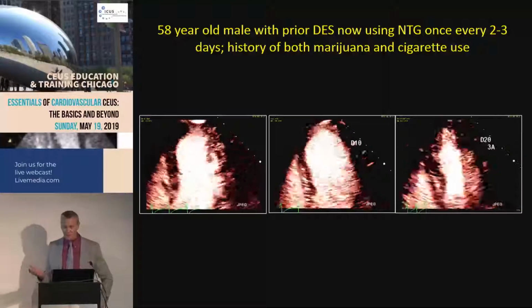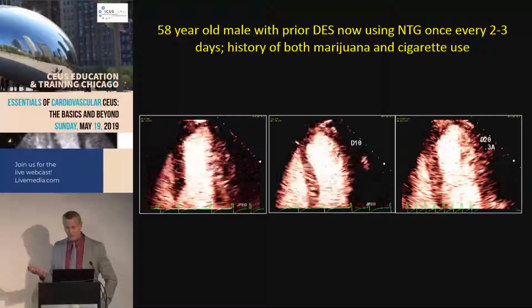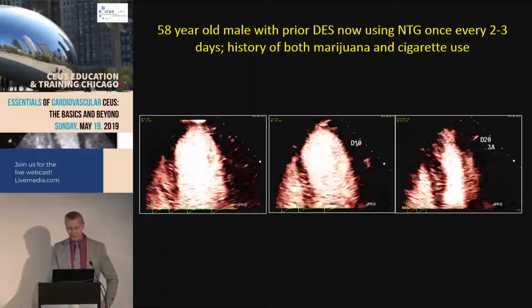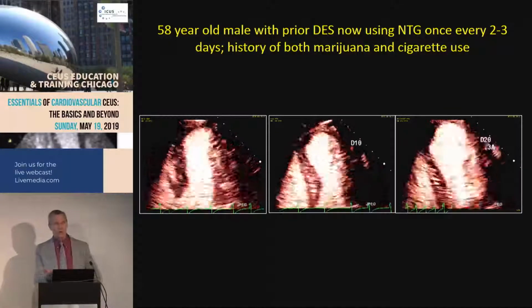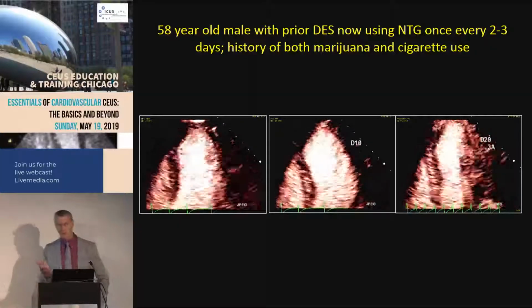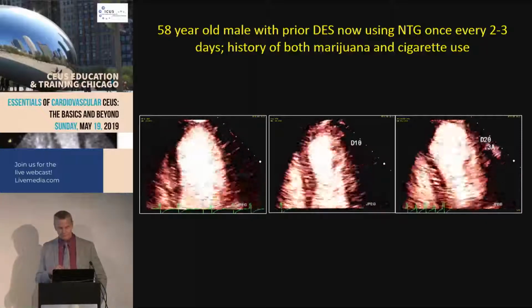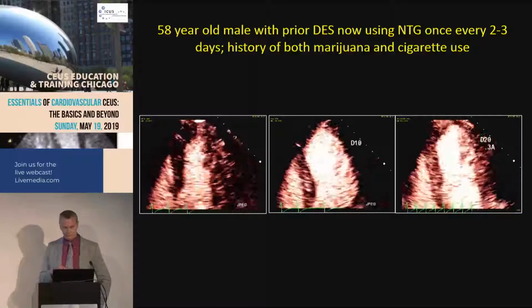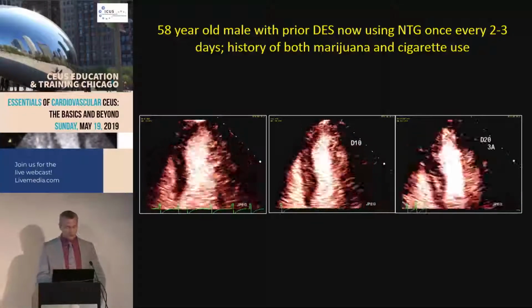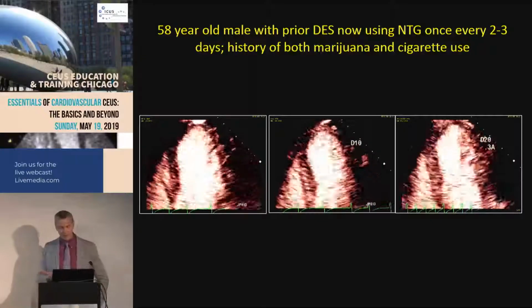But this guy had been using both, but he'd also been using more nitro, and then he had this history. So what do you guys think? So here's low dose. We always do an infusion about when they get a slight heart rate increase, because, as I'll talk about in a moment, perfusion often will become abnormal before the wall thickening abnormality, but here just wall thickening. What would you say? At peak stress compared to rest, I thought it looked pretty good. Didn't see a whole lot. Wall thickening looked pretty good.